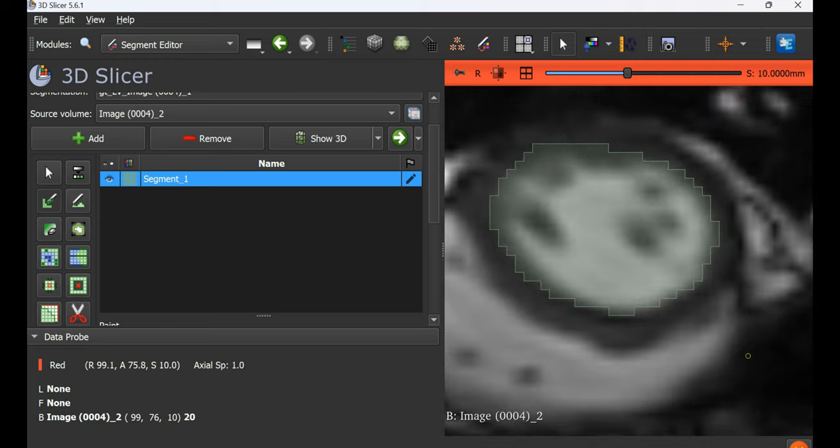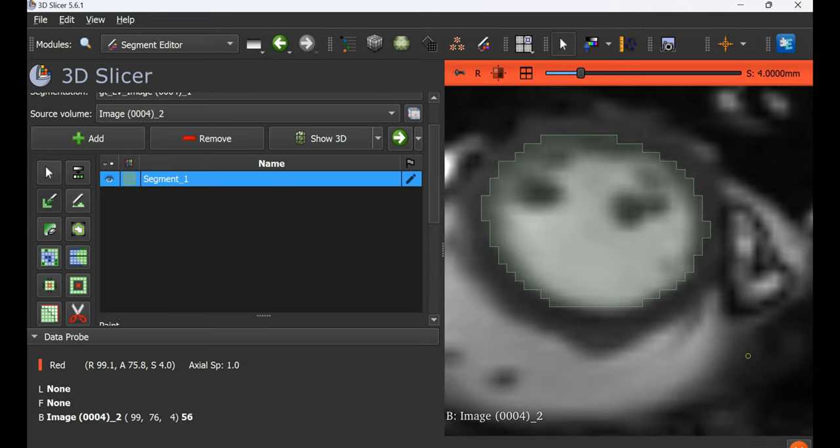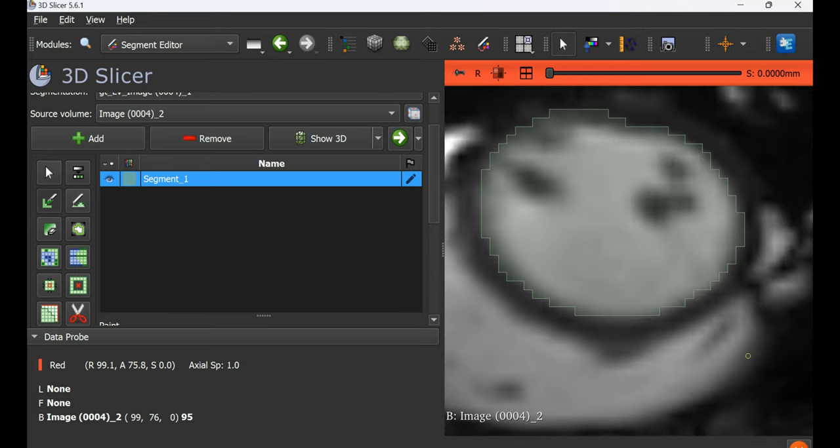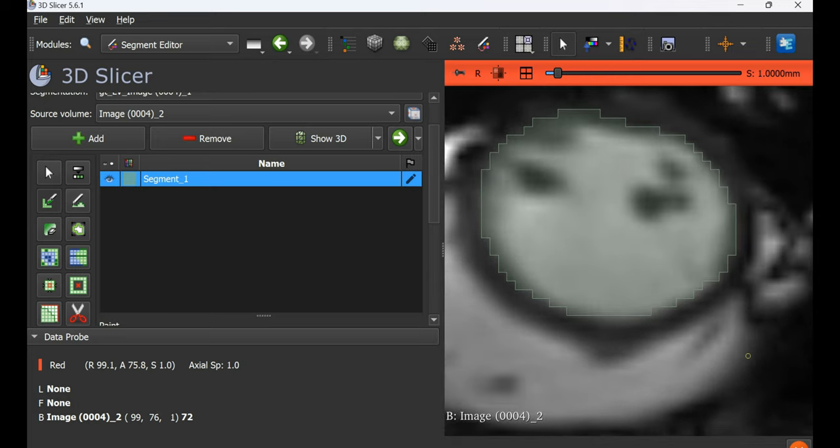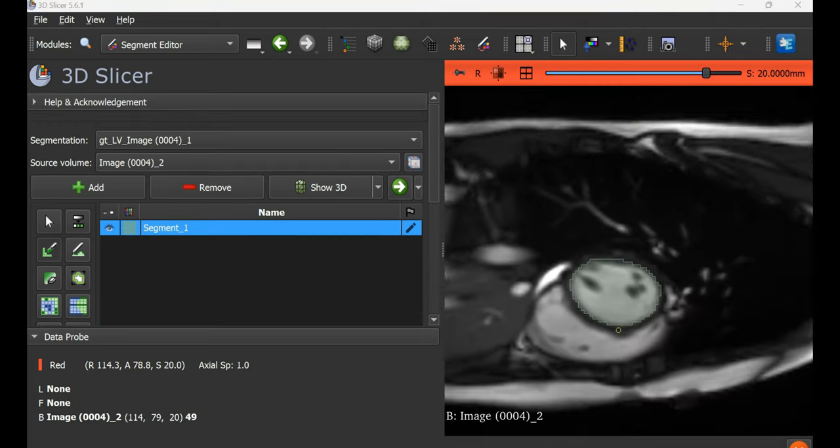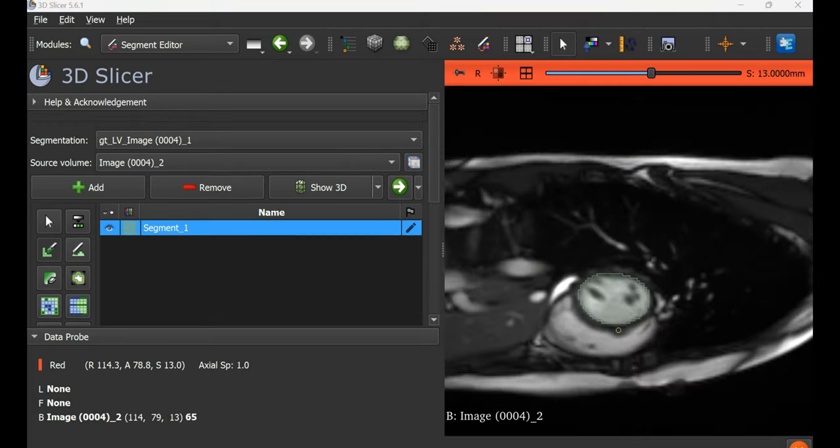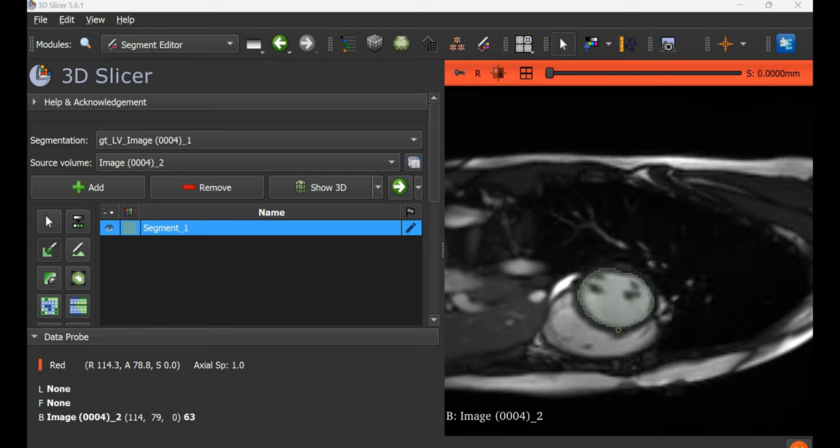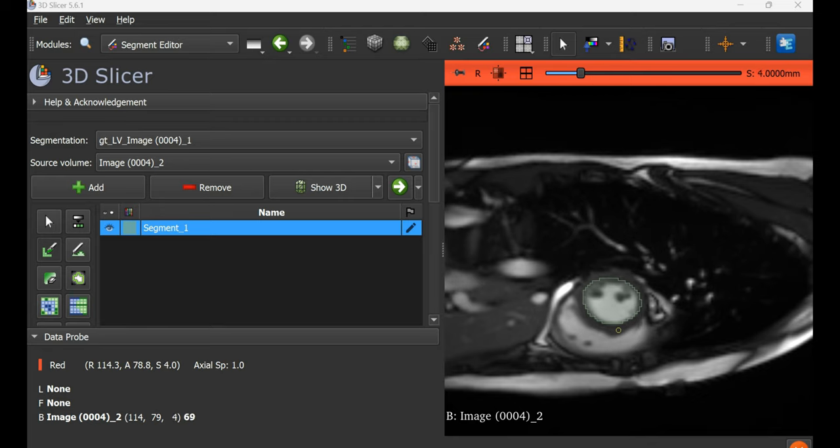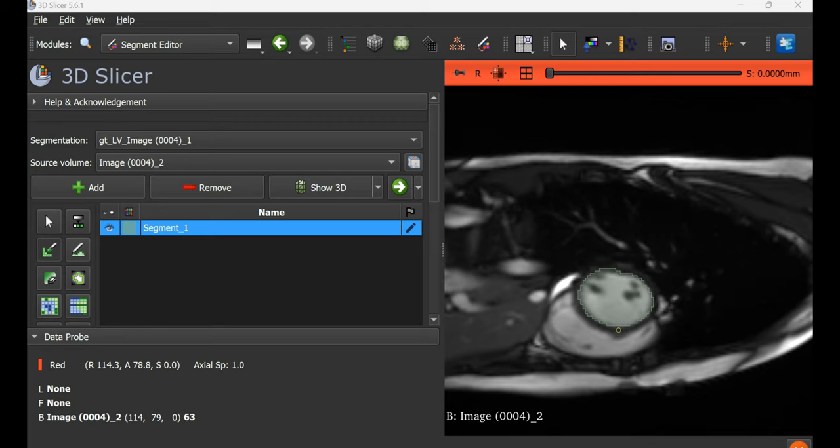Once it's done, we go through all the slices once while zoomed in and once while zoomed out to ensure no stray points are left here and there.